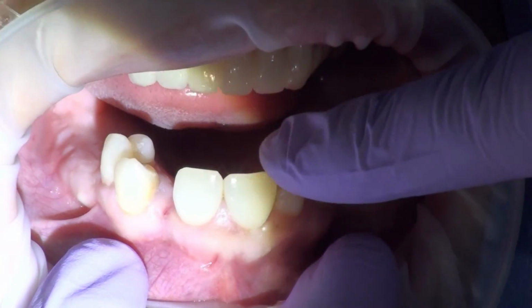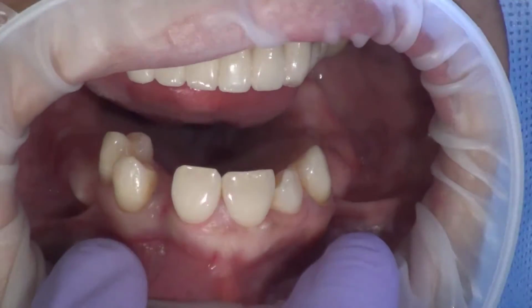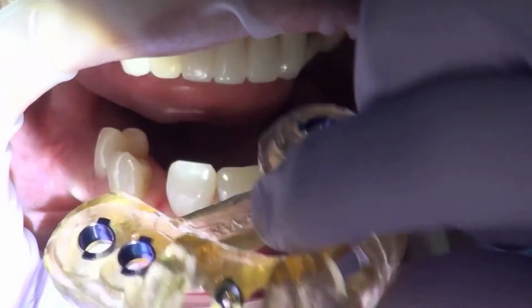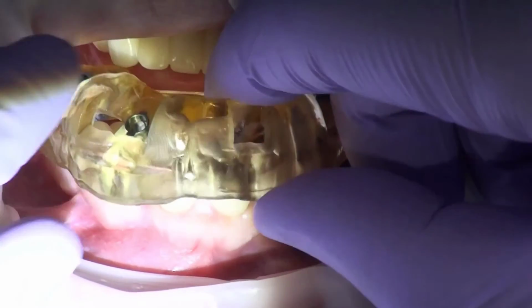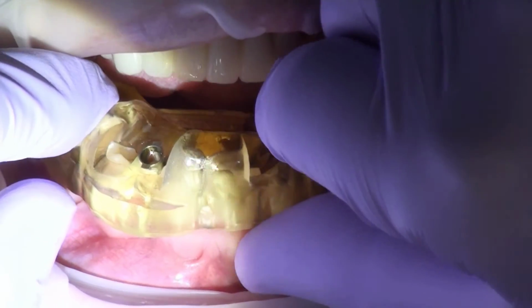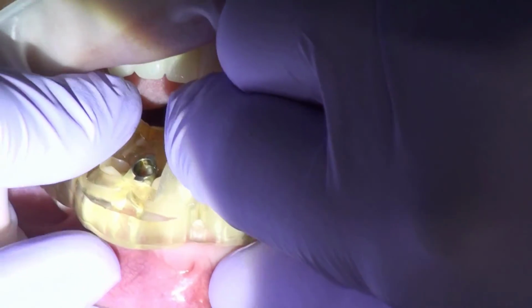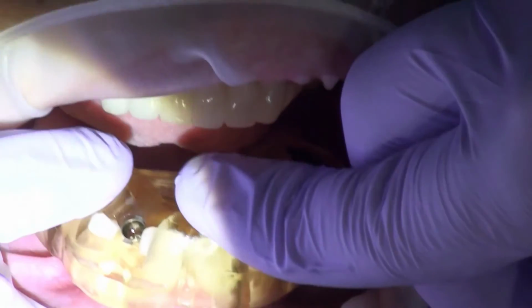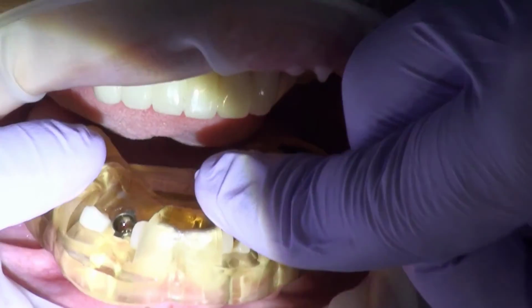The first thing we're going to want to do on any case is to make sure we try our guide in and it fits properly. This is always an exciting thing, because if this guide doesn't fit just beautifully, we can't start with our surgery yet. So I'm going to go ahead and roughly seat it, and then once I feel like we're lined up, I'm going to put some good pressure, and this one literally clicked into place, which I will take.